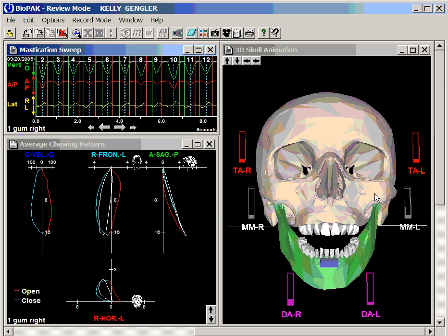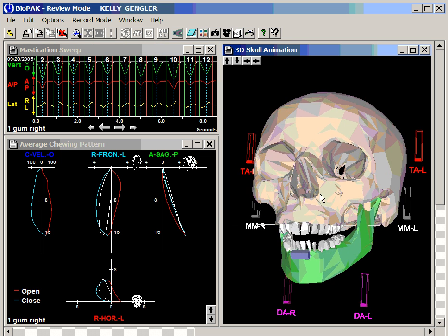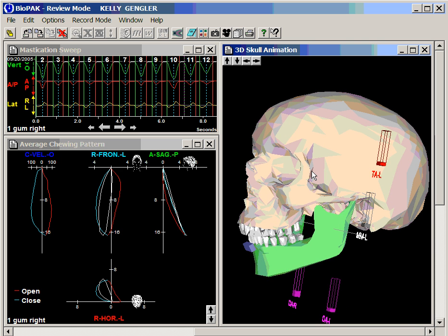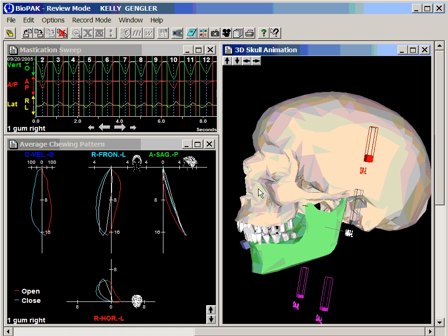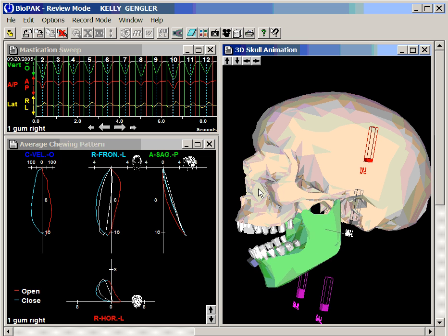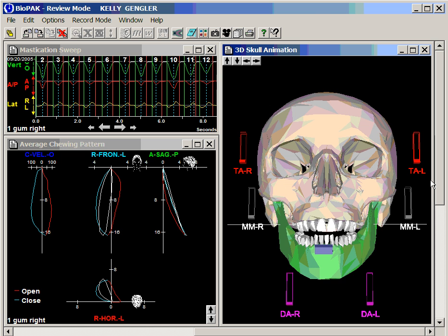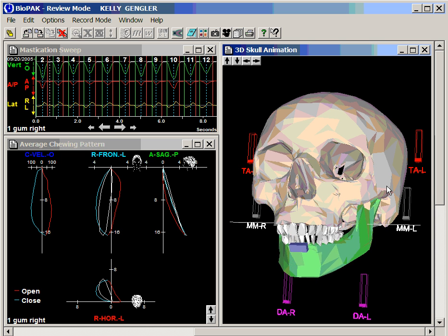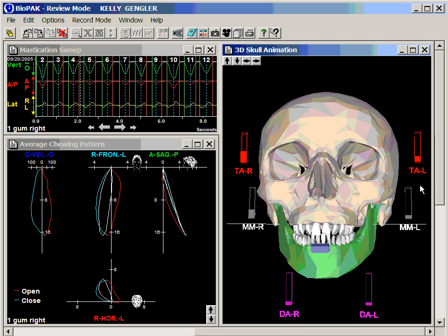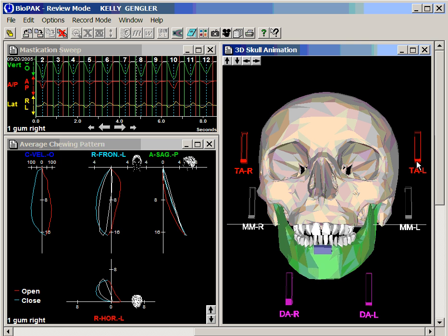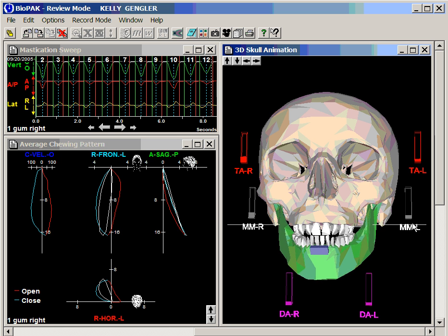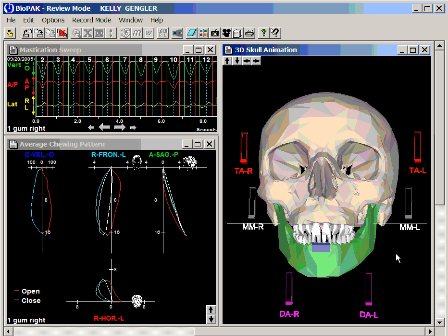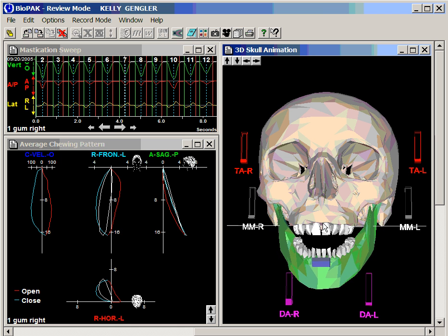Now we have the skull being animated and we can see in a sagittal view the movement of the mandible in the masticatory function. We can see the frontal view, the same thing. We also have the anterior temporalis activity being displayed, the masseter activity being displayed, and the anterior digastric activity being displayed.